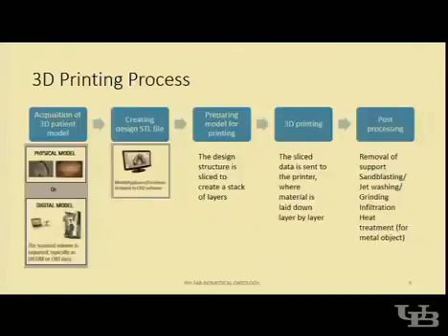So I start my ontology by identifying the processes involved in the product life cycle aspects. I'm not covering the part where the patient comes to see the dentist and so on. I'm just covering how they use the additive manufacturing process in these dental applications.